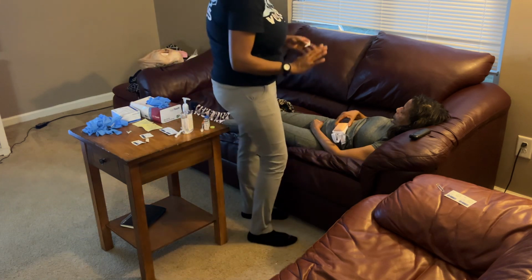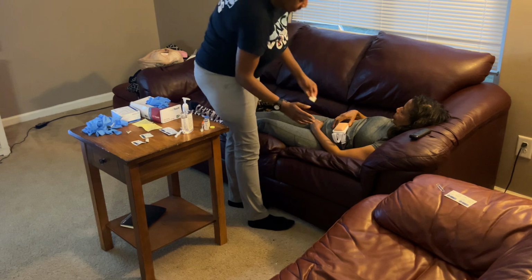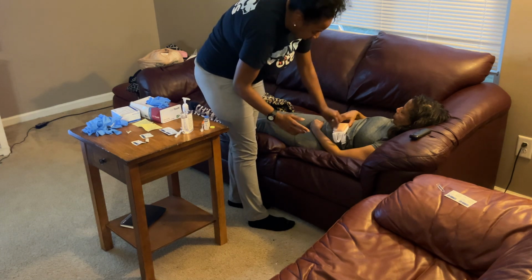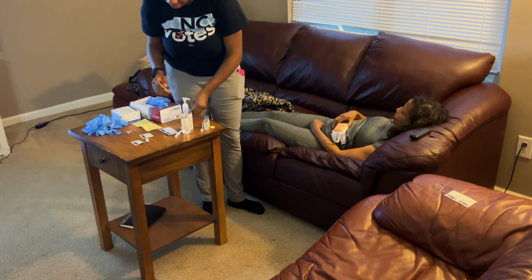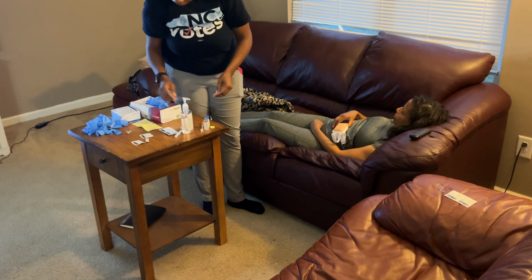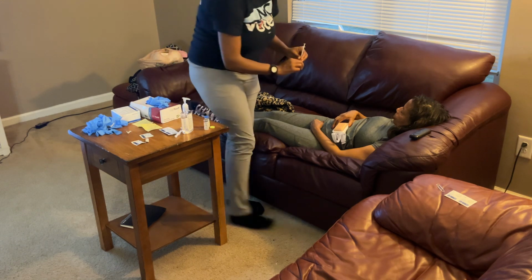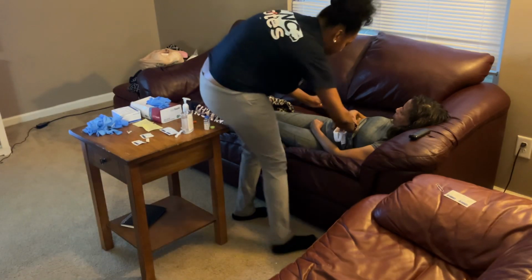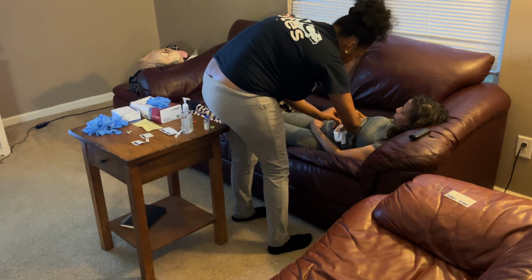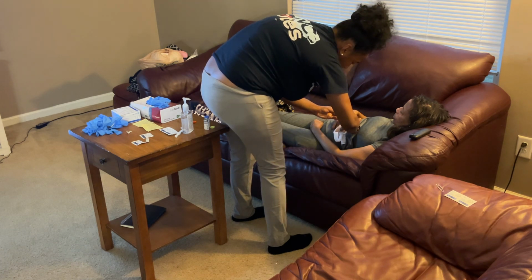All right, we are about 2 inches to the side of the umbilicus is where I'm positioned. And now, with my gloves on, I am pinching straight down, 90-degree angle.